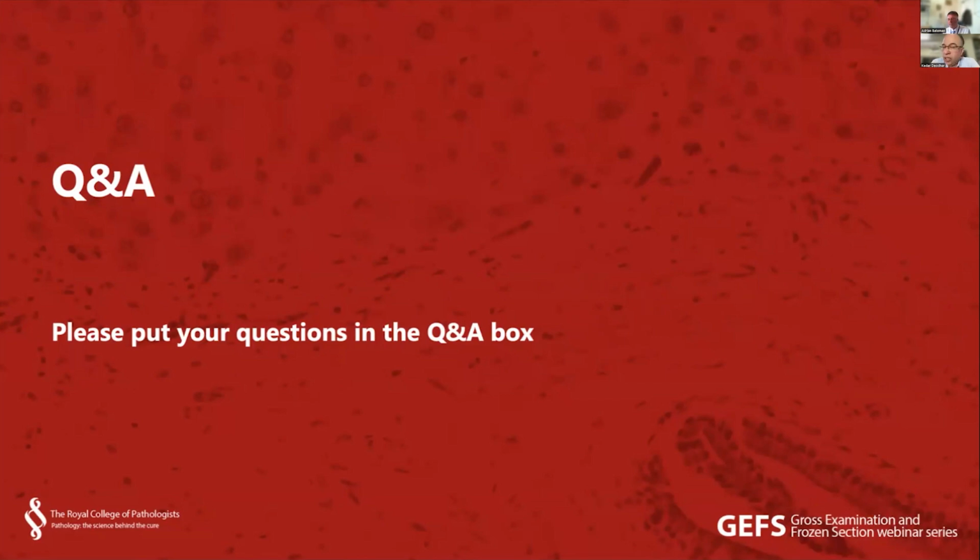Okay, thank you. I might insert one of the questions that bother us sometimes during our colorectal specimen reporting, and it's about the lymph nodes and mesenteric soft tissue deposits in the fat. Suppose I have two identifiable nodes which are metastatic, and in addition I have two separate microscopic soft tissue deposits. Sometimes we face a question: you mention those separately as per the guidelines, but do you take it as pN1B, or is it better regarded as N2A? I generally make a comment in the report, total 4, better regarded as N2A for MDT meeting. Would that be reasonable?